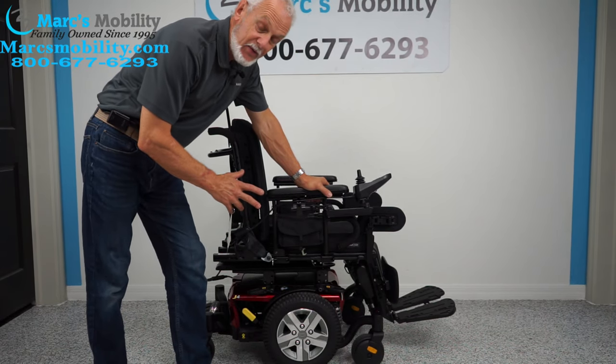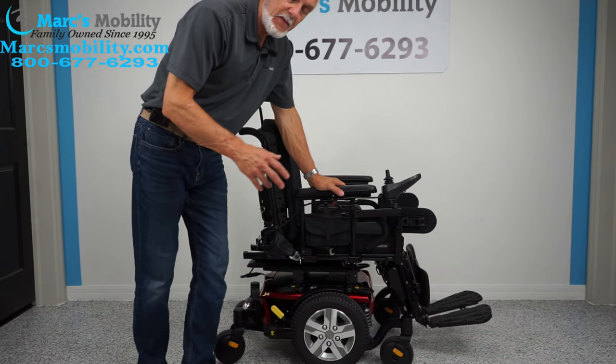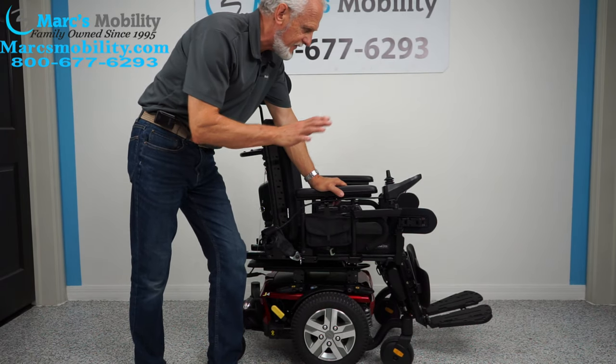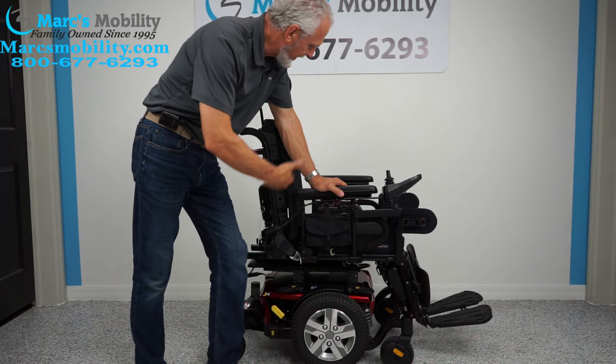Alright folks, we have a really nice chair here. I've never had a type of chair like this before. It's a Jazzy J4 power chair. This power chair has a top speed of 5 miles an hour. It was used for about a month — it's practically brand spanking new.